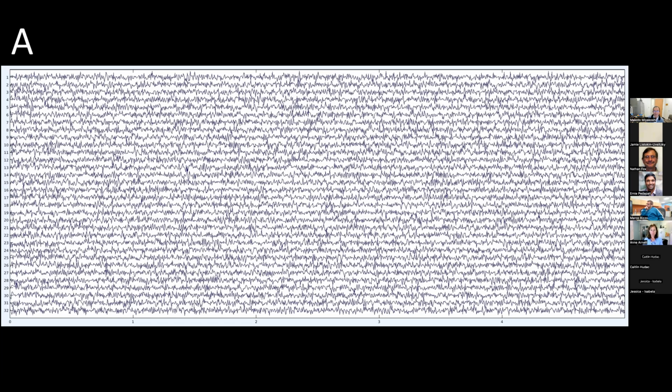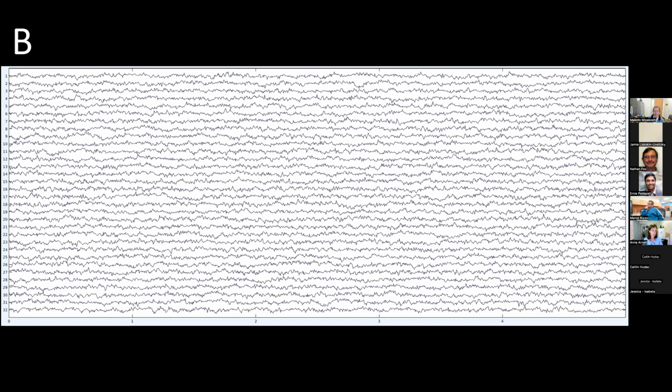I would say A contains a lot of high frequency noise because there are so many spikes, and also the lines seem really flat. Maybe too strong a high pass filter was applied or something, but this looks too noisy to me visually. B, yeah, this is more balanced between the low frequency wiggling and the high frequency spikes. Although we don't see the cross channel correlation in either case, A and B. That's because these are simulated data anyway.